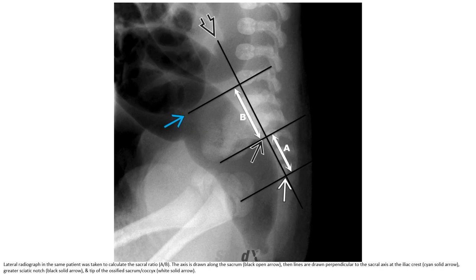A lateral radiograph in the same patient is used to calculate the sacral ratio. An axis is drawn along the sacrum, then lines are drawn perpendicular to the sacral axis at the iliac crest and greater sciatic notch, and the tip of the calcified sacrum is identified.